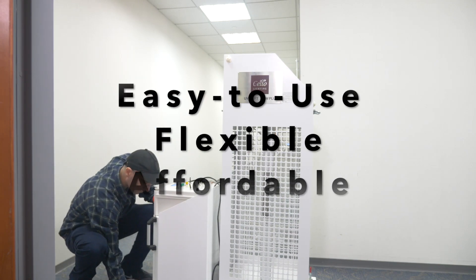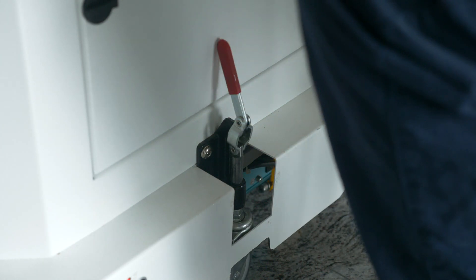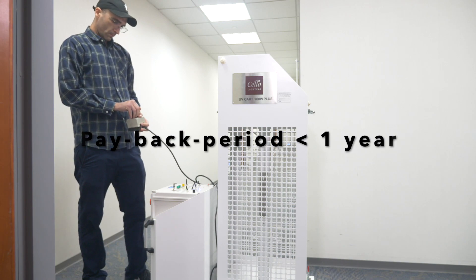The cost of the Cello UVC robot is less than one-third of those of other UVC robots. The payback period to replace the labor costs is less than one year.